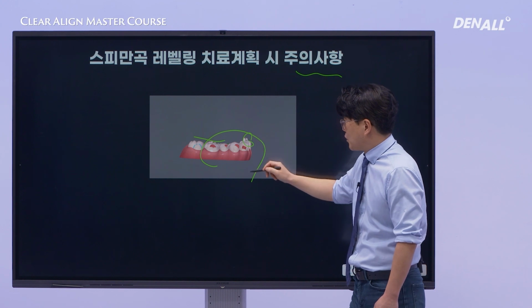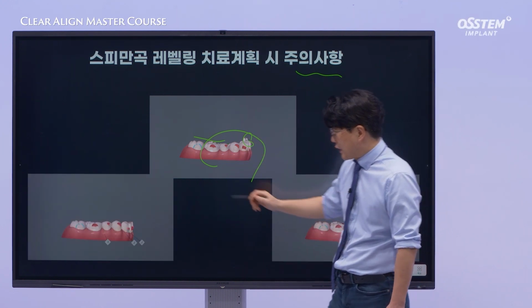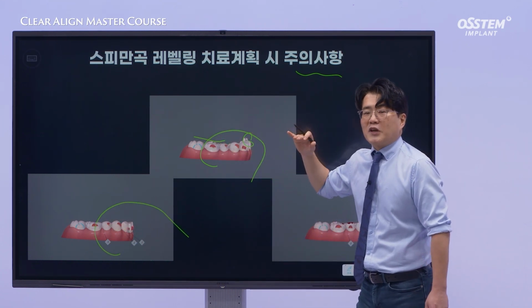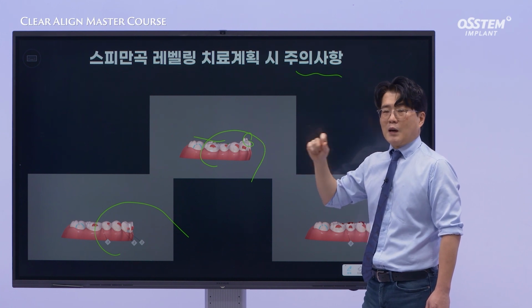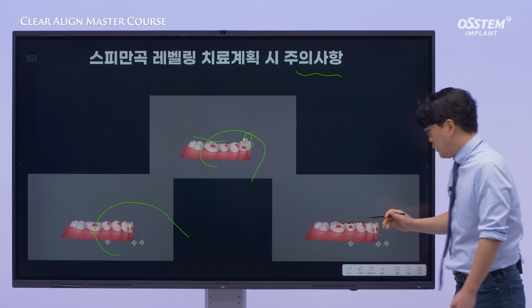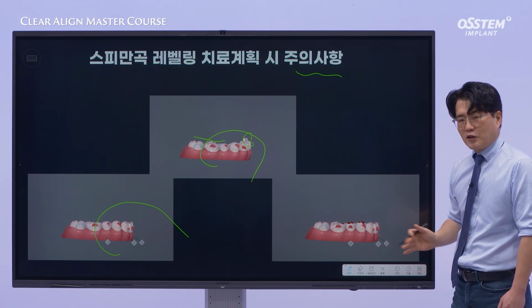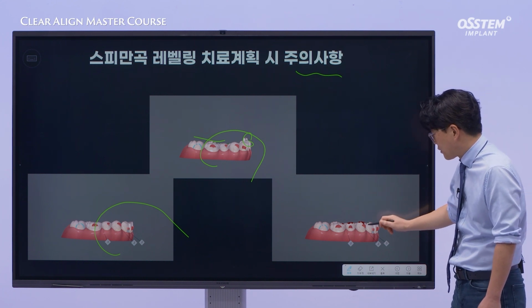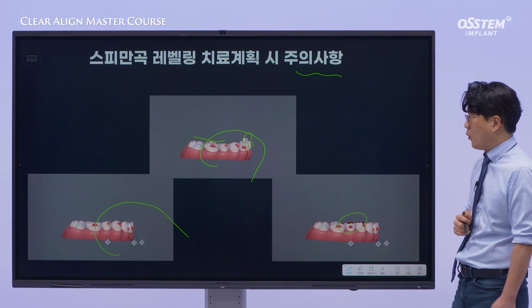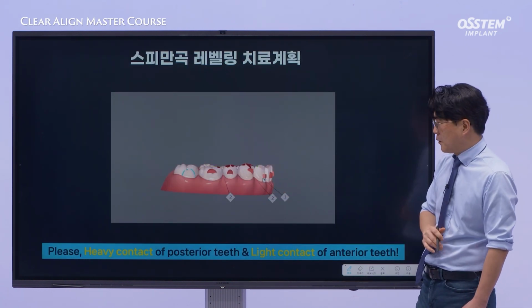However, there are precautions to keep in mind. As you can see here, in cases of deep bite, the mandibular anterior teeth are extruded. As mentioned earlier, leveling should begin with these considerations in mind. This works well, but when the curve of Spee is excessively deep, we need to plan for some degree of overcorrection or over-engineering, just as we would in bracket-based orthodontics. As a result, we often request overcorrection for creating occlusal high spots in the premolar region.